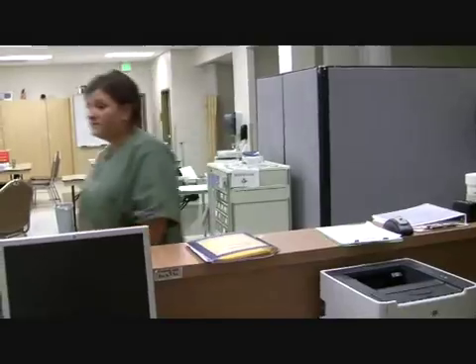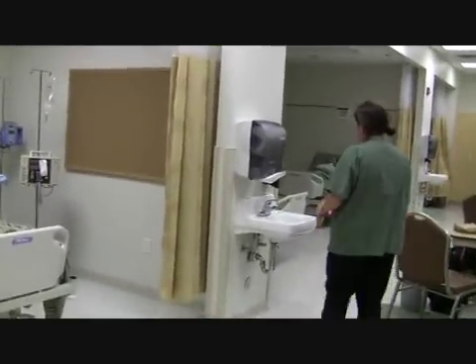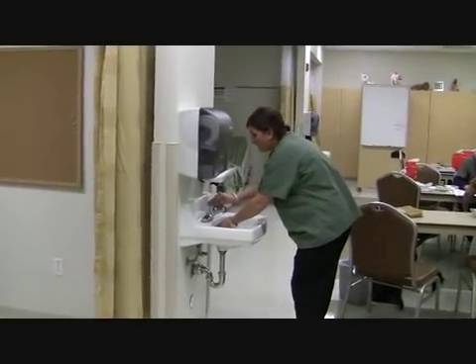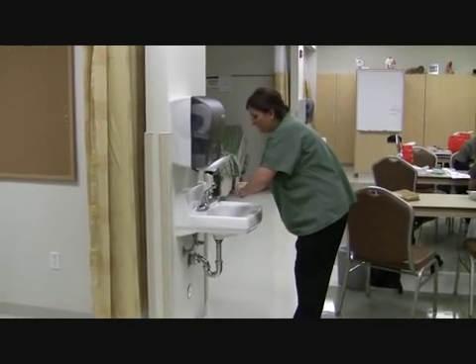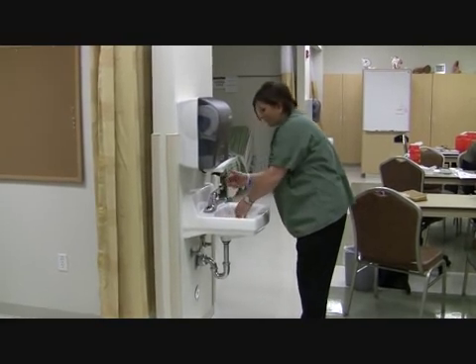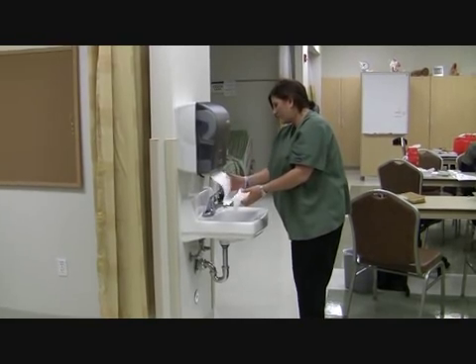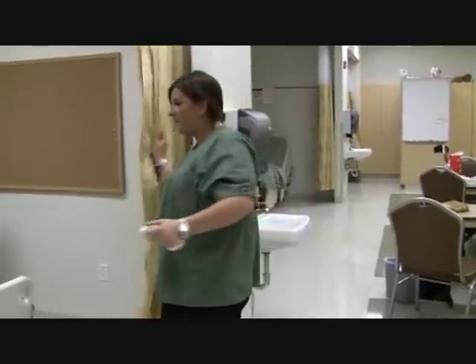Okay, so we're going to go in the patient's room. Patient's card. I'm going to wash my hands. Provide your privacy.